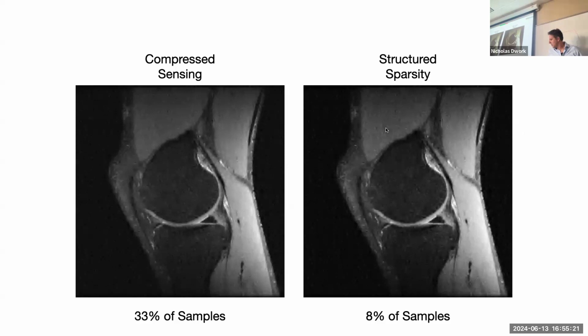We're using the L1 norm right now as the sparsity objective function. The L1 norm induces actual sparsity, values go to 0. But we know that our true image has Gaussian noise, so you wouldn't expect the wavelet transform to be actually sparse. You'd expect values within the noise bound. There's already a way to deal with this, the Huber penalty. So we're going to replace the L1 norm with the Huber penalty.